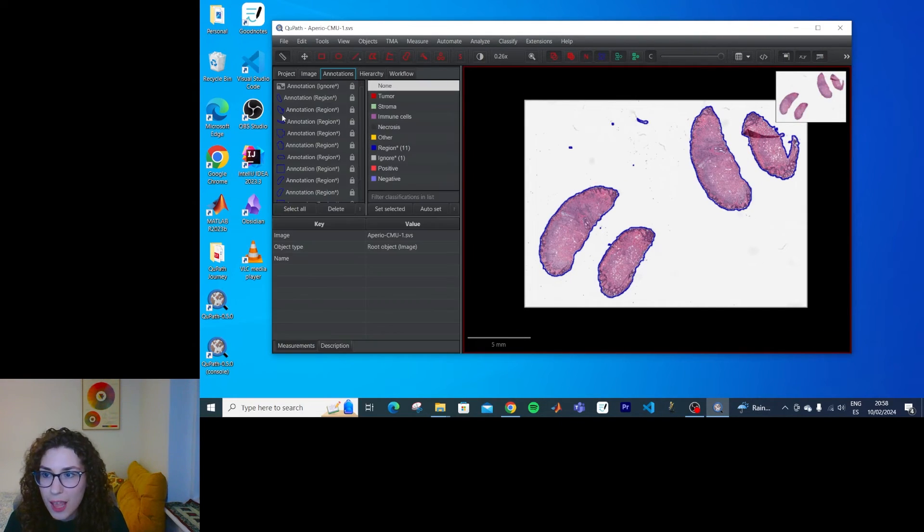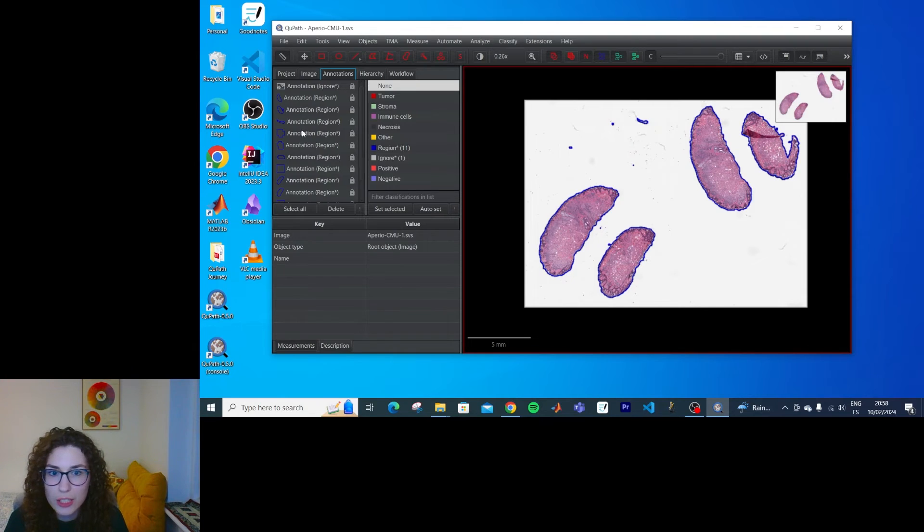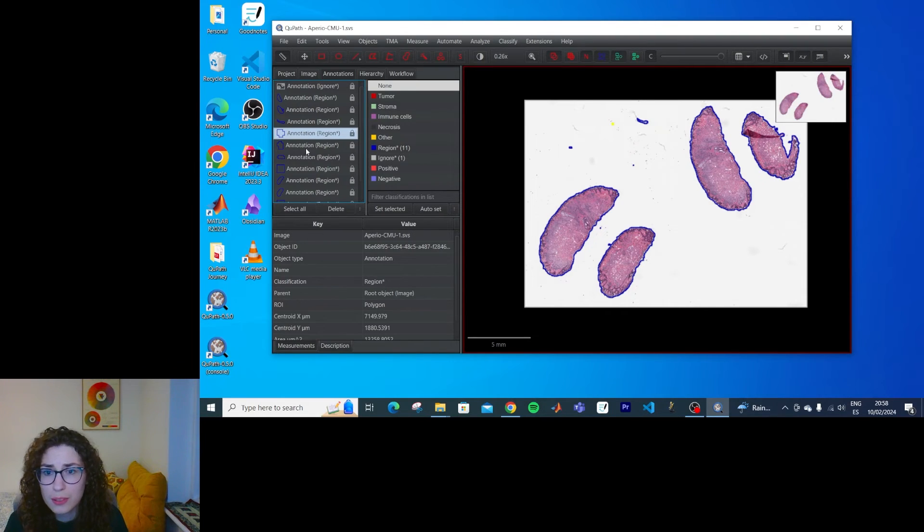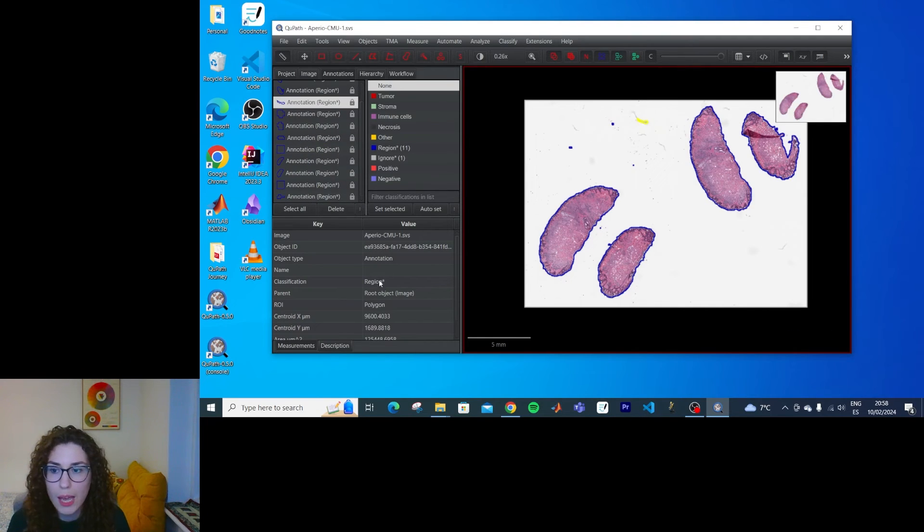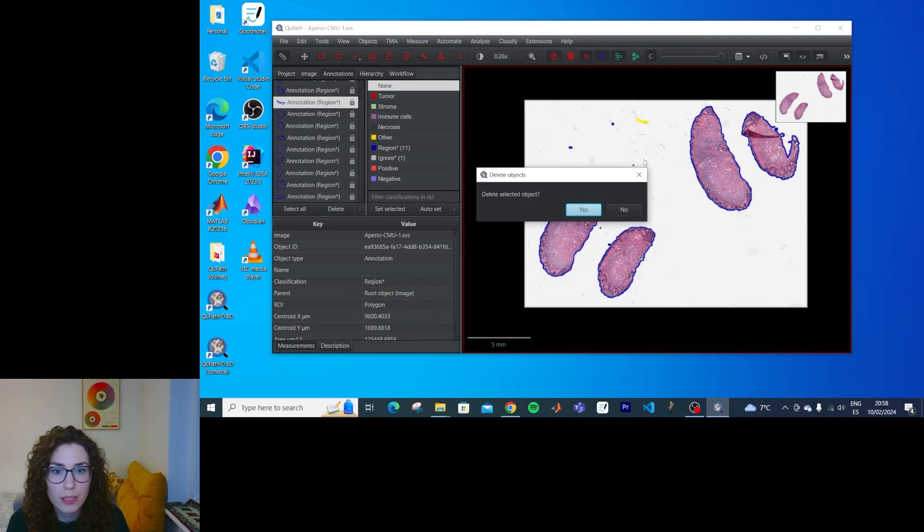And I guess that now I could delete the annotations that I don't need, like this one. This one I do need. Oh, maybe I should just click on them and delete.